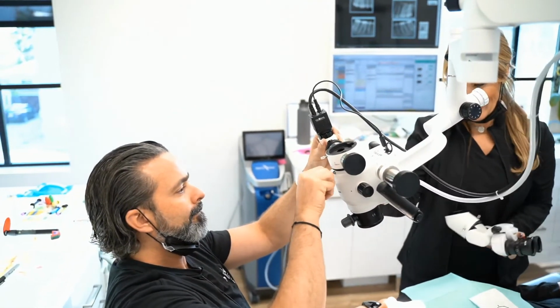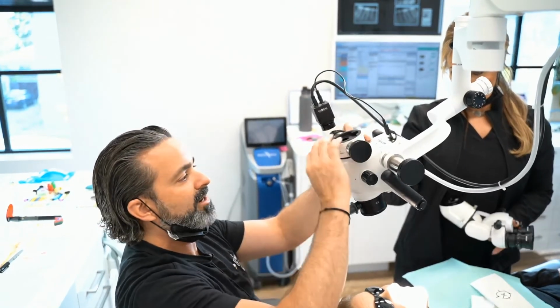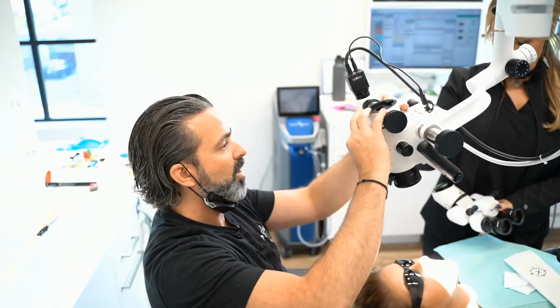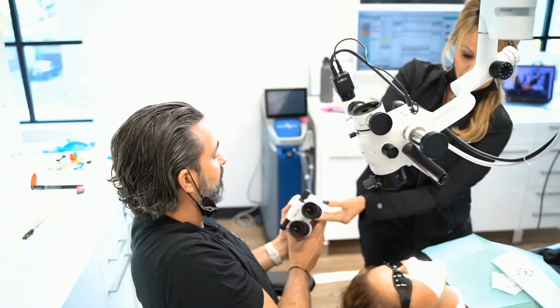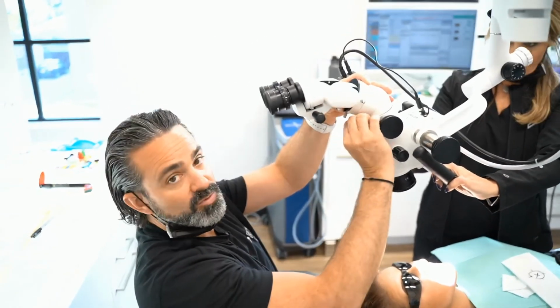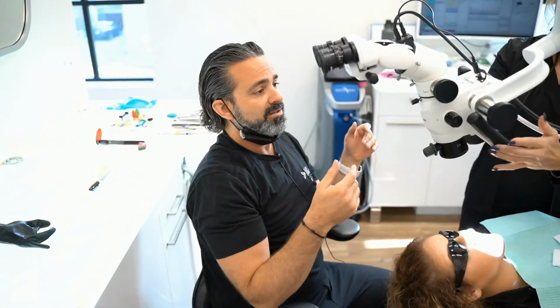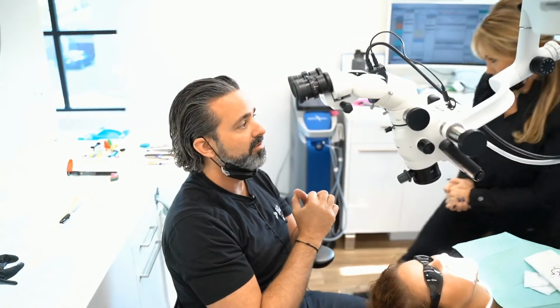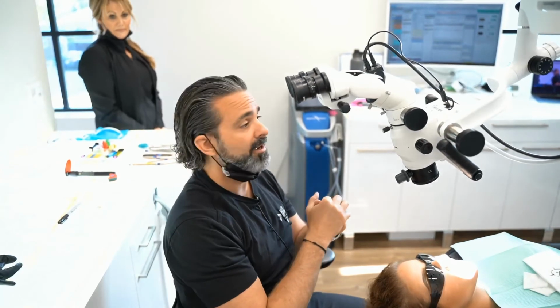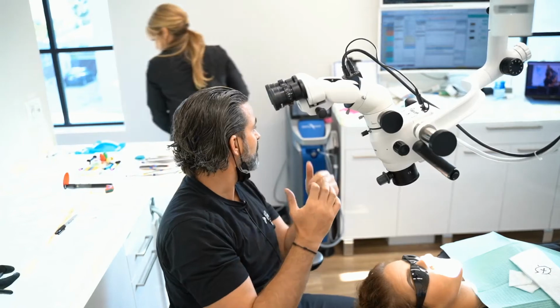When you look at microscopes, these little tweaks that I'm talking about, and why you stack and what your agenda really is, are why working with a microscope is really important. I needed what I wanted out of the deal, and so Seiler really fit the bill on what was important for me. So that's my sales pitch for Seiler, I guess. Any other questions?